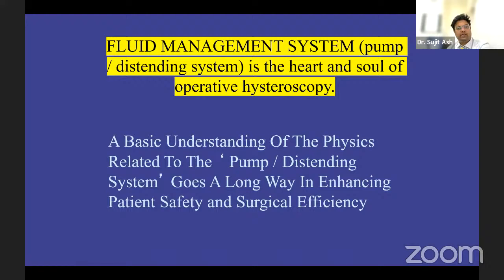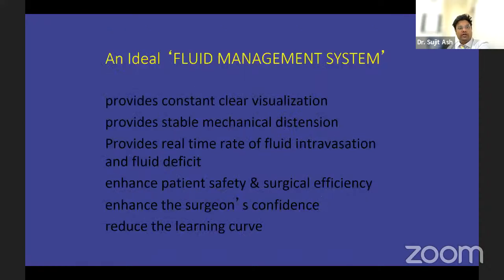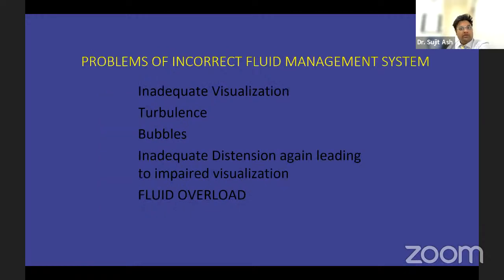You need to understand the basic system of physics when you're doing this so that patient safety is maintained, so that you maintain the pressure along with your mean arterial pressure, and that is what will give you a proper distension. If you don't have a proper fluid management system, then you won't be able to see your cavity properly. There might be a lot of bubbles. That is why I told you to remove the bubbles.